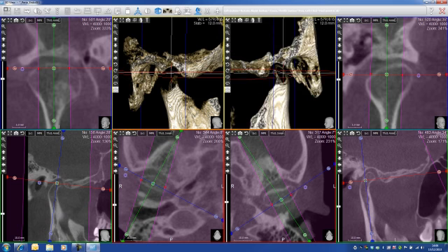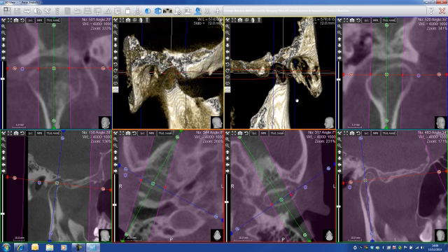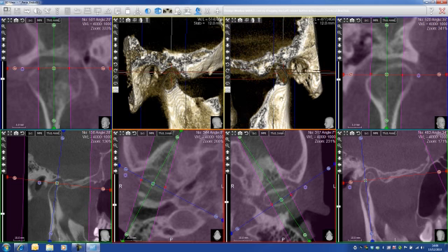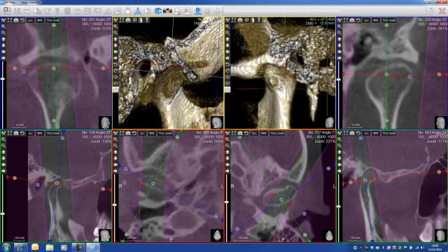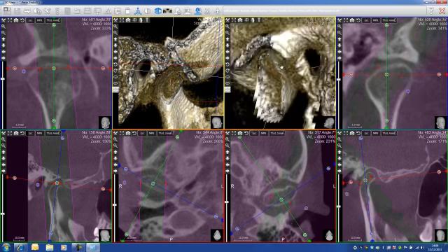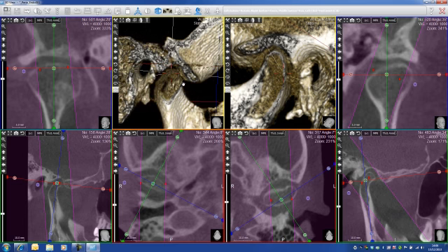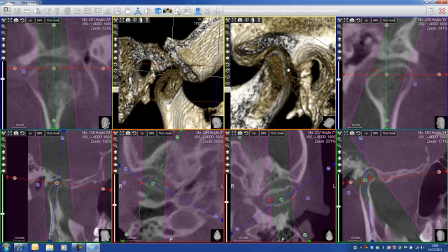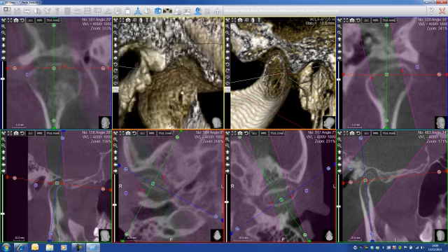Of course I can play with the contrast, which will increase the level of bone. I deselect contrast and I can see both condyles in 3D dimension. I can always use Control and left click to increase or decrease the bone density level. I can see the TMJ pretty well now.